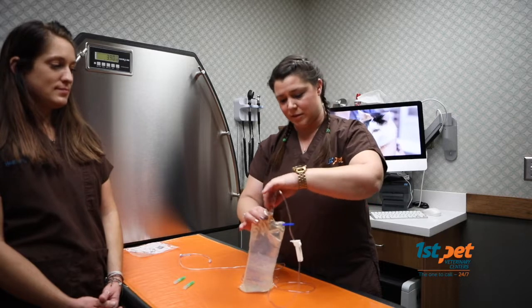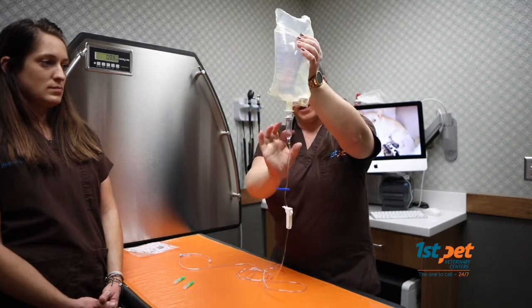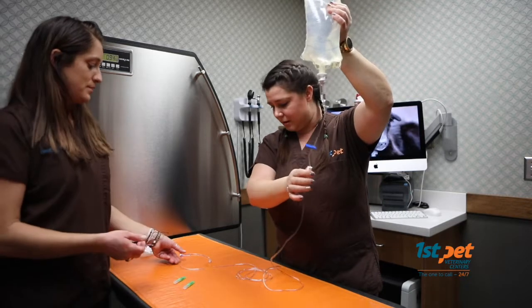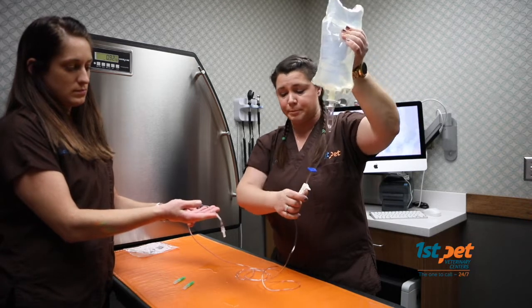Once you've stuck this into your bag, you're going to turn it over and give the little thing a squeeze. This kind of fills your line up. And now we're filling, it's called prepping the line, and you can see we have fluid coming out the other end. You want to do that until you have a pretty good steady stream.